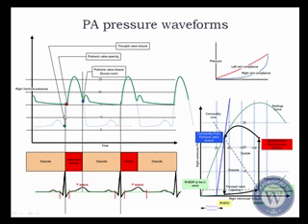The healthier the contraction is, the lesser the time change between the tricuspid valve closure and the pulmonic valve opening. This point between the red point, which is the pulmonic valve opening, to the pulmonic valve closure, which is the blue here, is consistent with the changes on the pressure volume curve between the pulmonic valve opening here in the red to the pulmonic valve closure here.